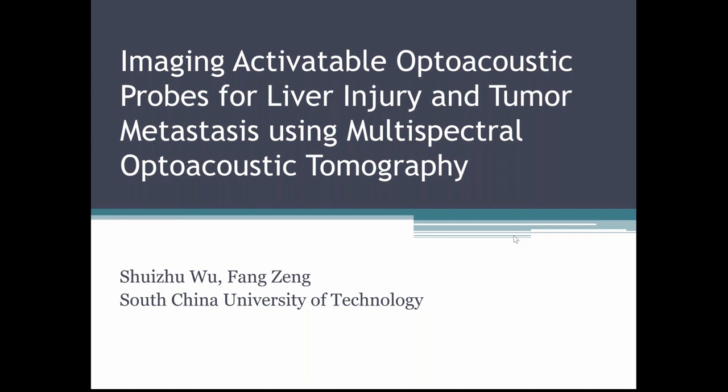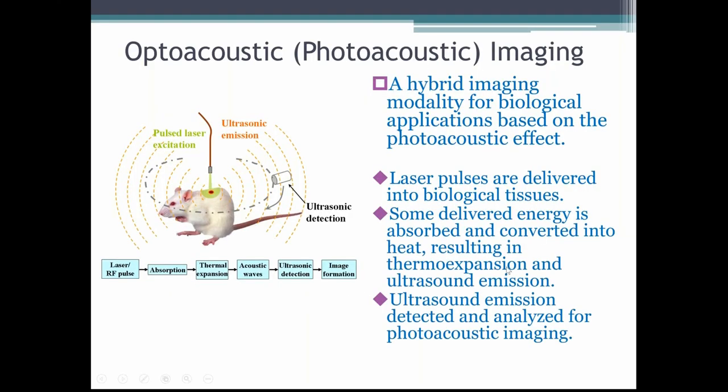Thank you, Dr. Chu, for the invitation and the nice introduction. And today I will talk about our recent work involving activatable optoacoustic probes for MSOT imaging. I will begin with a brief introduction to optoacoustic imaging, also known as photoacoustic imaging. Optoacoustic imaging is actually a hybrid imaging method for biological applications based on the photoacoustic effect.